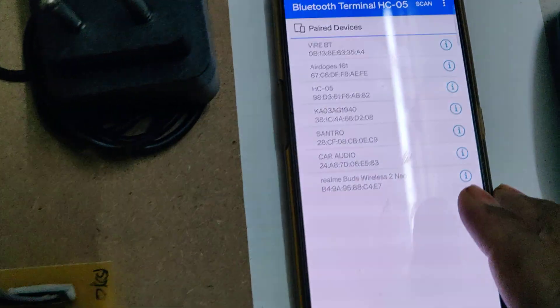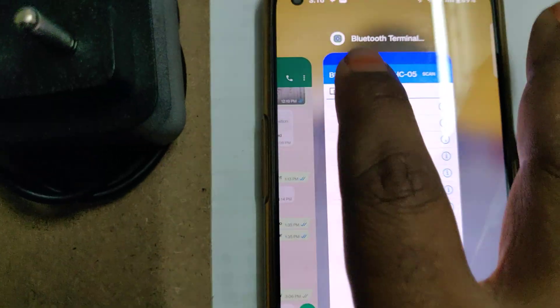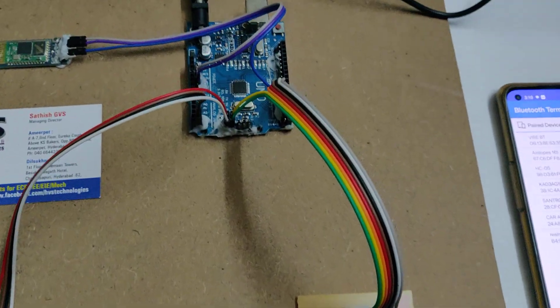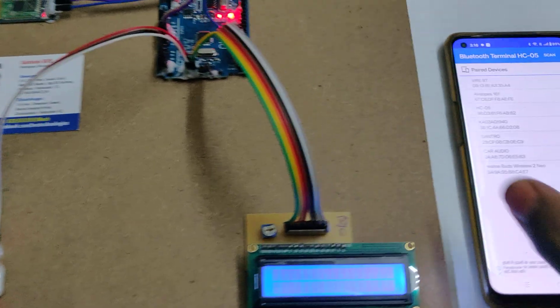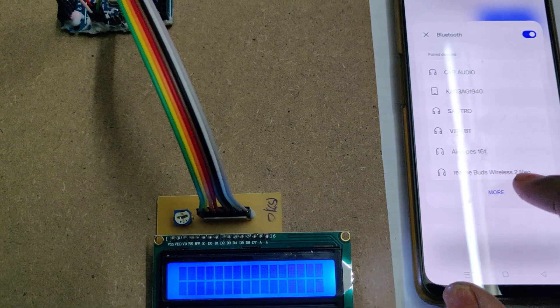Before the demonstration, install the application — the HC05 Bluetooth terminal application. After installing that icon, you can turn on the power supply to the device. After switching on the power supply, a welcome message will be displayed, and then go to the Bluetooth settings of your phone.